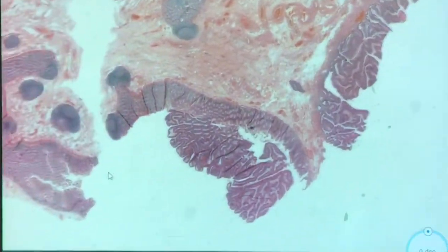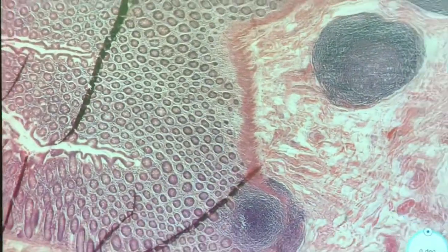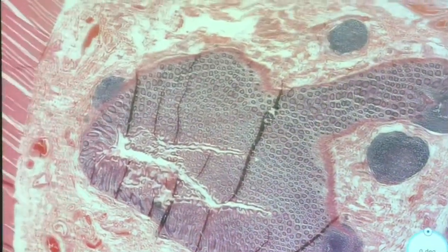And I don't think there's any lesion here really. This is just in, ooh, look at that, it's so pretty. But it's just in cross section really, tangential. And there's nothing here. So I think that's the lesion. So is it TVA? This is a TVA.